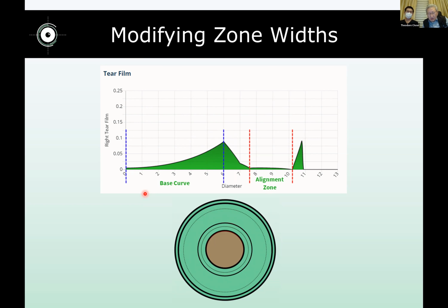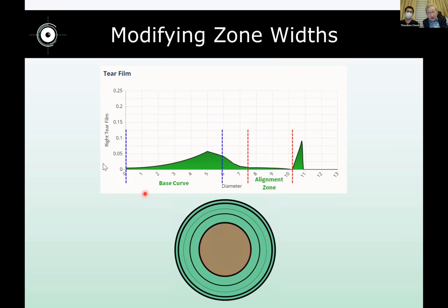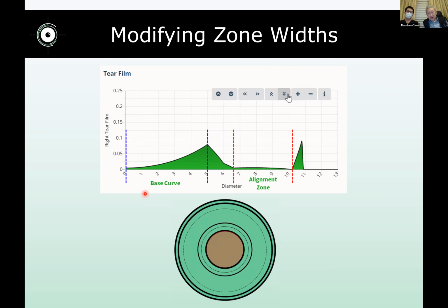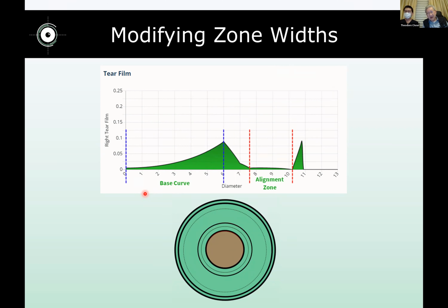No. You can go over the superior limbal area by a little bit, not sacrificing the overall diameter, and the software will help you design the lenticular fringe area so that it is not going to impinge on the superior limbal area. Go as large as possible. With a small HVID patient, a lot of Asians with 10.4 HVID, how are you going to cope with it? Then you have to sacrifice the optical zone to a smaller one. Usually my average optical zone diameter is from 5.0 to 5.4, rarely 5.6 or over. If you have a large HVID, 12 millimeter, then the overall diameter is 11.6, and then you can go 5.6. This is my experience.